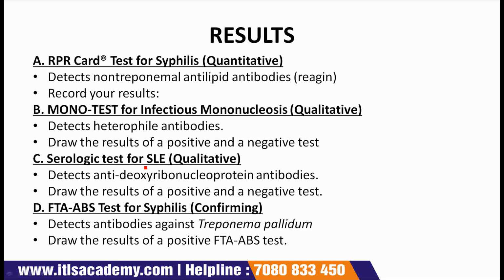For the SLE results, this detects anti-deoxyribonucleoprotein antibodies. For its results, draw the results of a positive and a negative test.